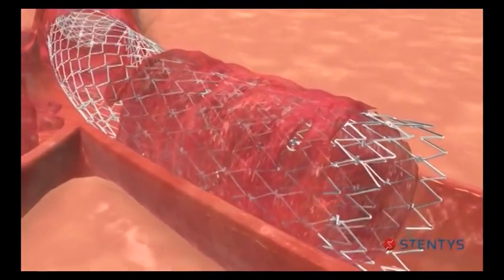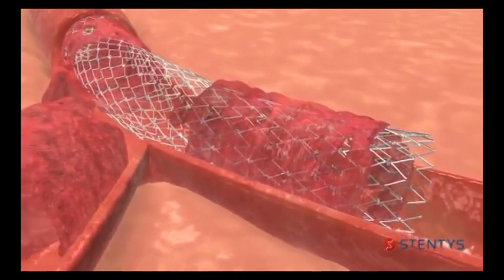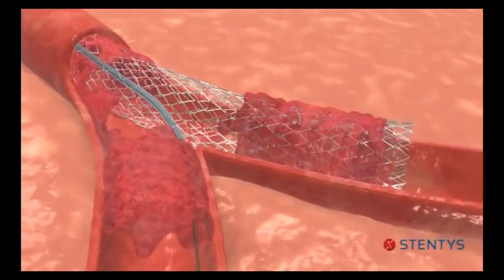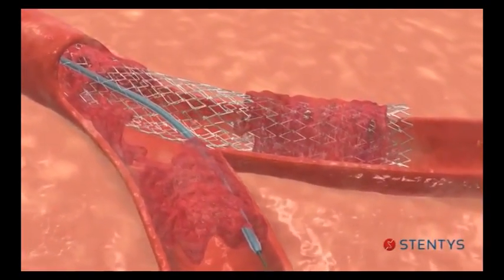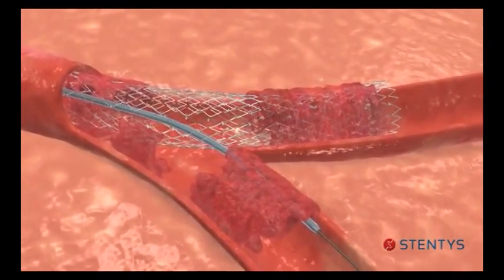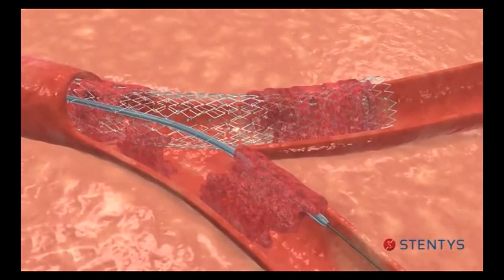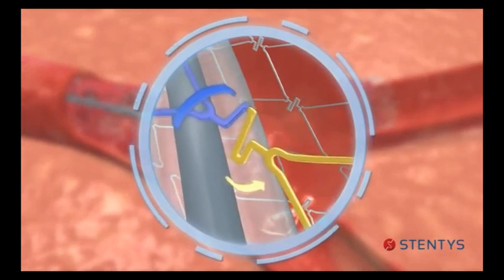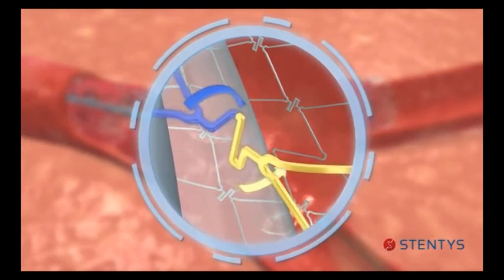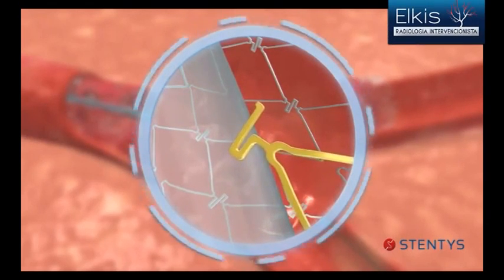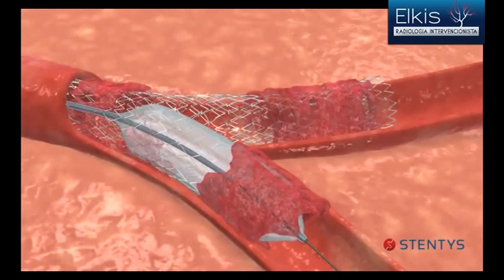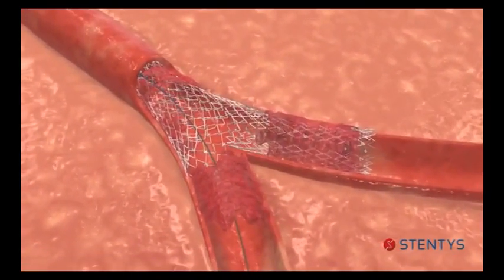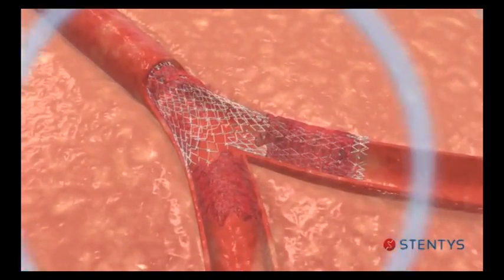If the Stentis stent is deployed across a significant side branch and access or treatment of the side branch is desired, a guide wire and a balloon are advanced through the stent mesh and into the ostium of the side branch, as would be done with a conventional stent. Rather than deforming the conventional stent struts, the balloon inflation gently separates Stentis' proprietary connectors at low pressure thanks to a combination of flexion and rotation. This allows the free mesh to cover the side branch ostium, providing uncompromised access to the side branch for optional further treatment.